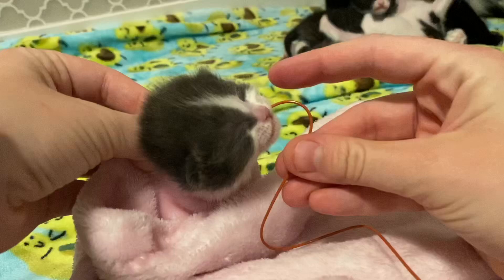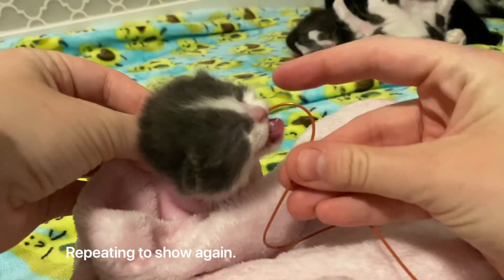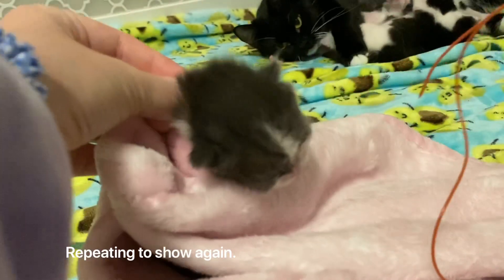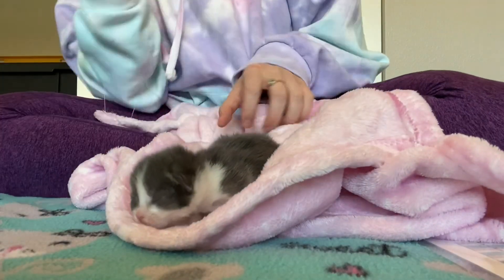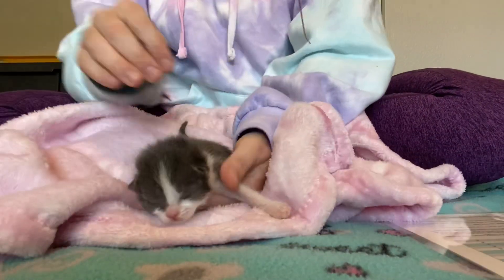Something I should have included here is when you're taking the tube out, you should kink it so that when you pull it out, no milk can come out of the tube and into the lungs and cause the kitten to aspirate. If you are tube feeding a neonatal kitten without a mom, make sure to stimulate them to use the bathroom after you are finished.